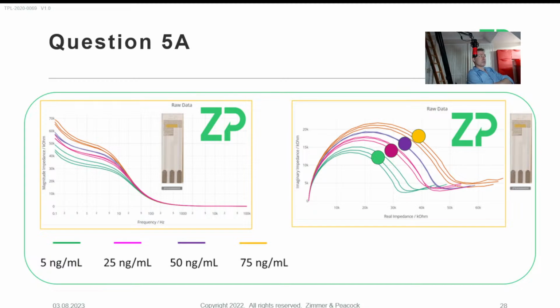People have a real problem with screen printed electrodes. It's because they're not reproducible. Therefore, they have to actually do calibration in the real world, which you can't do. It's not a good idea to do it. You can do it in things like the blood gas analysis that I was talking about earlier on. That's fine because that instrument has size, it has volume, you can have calibration solutions on it. That's a good place to be doing calibration and wash. But when you're trying to do this, a wearable biosensor, an application where it would be wearable and implantable, you cannot do calibration in the field. You can do things like relative change in signal over time and call that your signal.